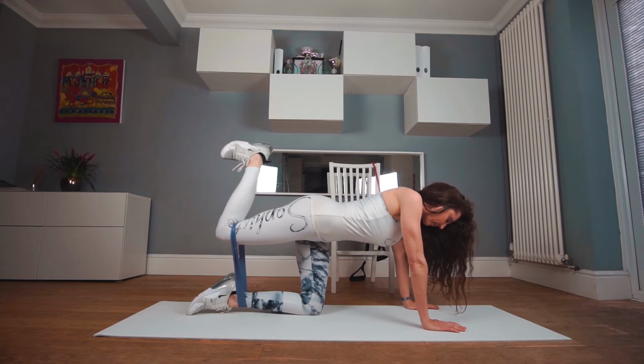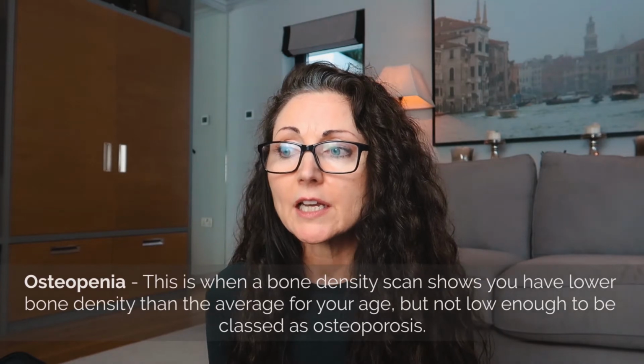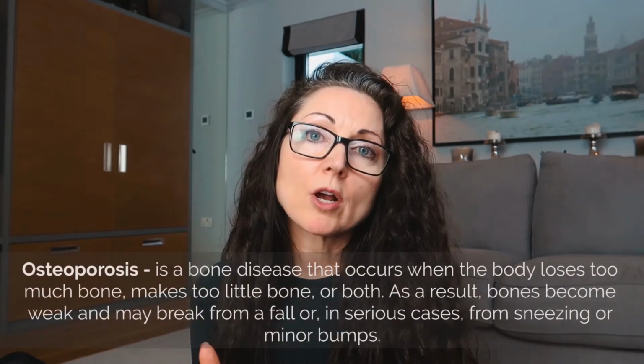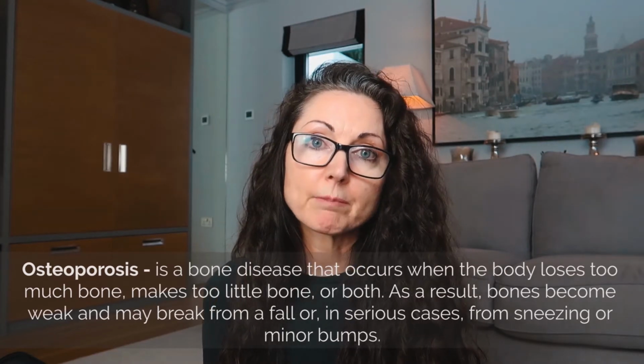So listen to this bit. Your bone density is slightly below 1. All right, so they measure the spine is -1.3, okay? So that's not so good, but the bone density in my hip where I have the arthritis is -1.9. So that makes me osteopenic. It means your bones are slightly low in density. There is a but. Still some way off osteoporosis. It would be a lot worse if I hadn't been on HRT for the last 8 years. So HRT helps with bone density.